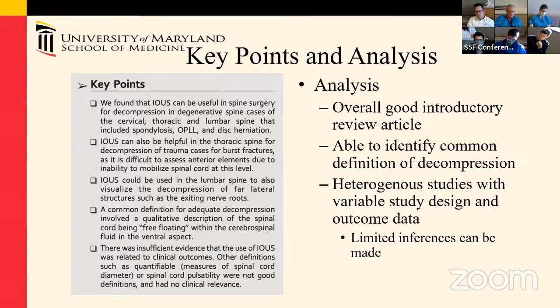I think it would have to be a corpectomy, and it could certainly have good use if the patient has posterior ligamentous buckling. You would be able to see whether there is still some posterior compression of the spinal cord, or whether, when you distract open with your distraction pins, that posterior buckling goes away. But I haven't tried it, so I'd be curious to see whether our probe is able to do that.